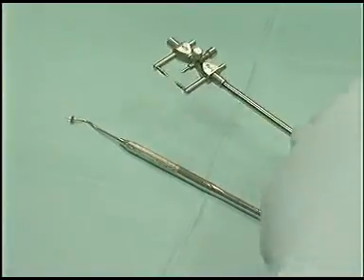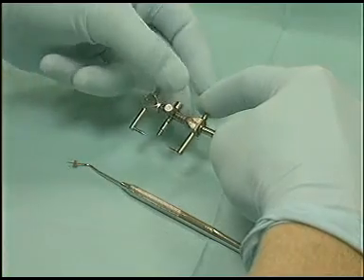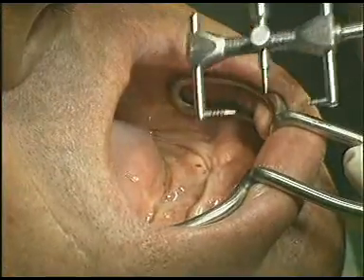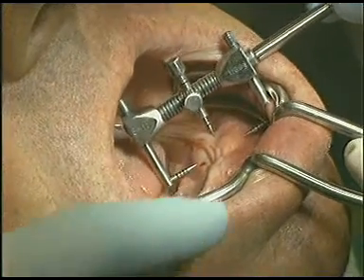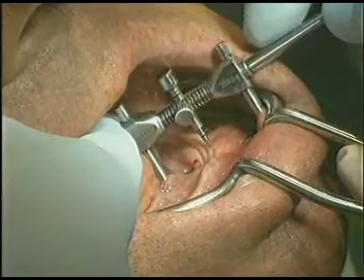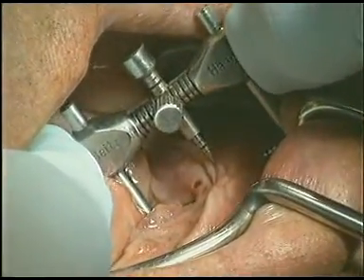The Mainz two-dimensional slide rule is more ergonomic and easy to handle. This instrument can be used to probe and record the width of the alveolar ridge at predefined spots and different heights. It determines the thickness of the mucosa simultaneously.